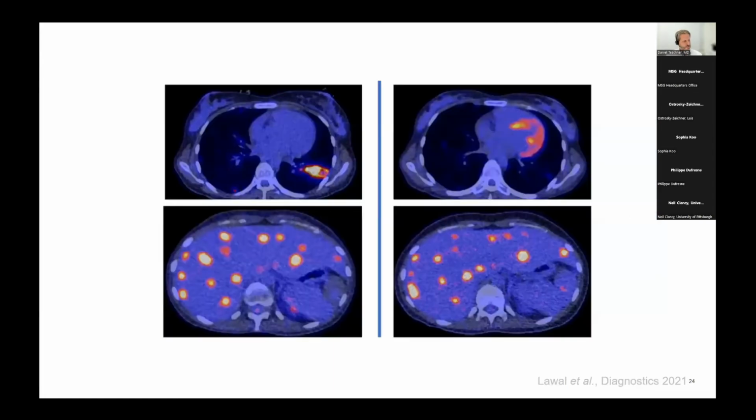And here another example: there was candidiasis, with involvement of the lungs. I think we can discuss extensively whether this is feasible or not. But here we have the lung lesions and we have the hepatorenal or hepatosplenic invasion of the Candida.